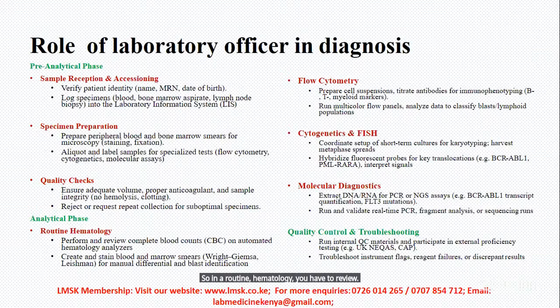You have to create and stain blood and marrow smears on the slides. And stain with simple things, even the Diff-Quik, Field stain can stain. You can use the Giemsa, the Leishman stain. And then you have to be able to identify even a blast on the microscope.